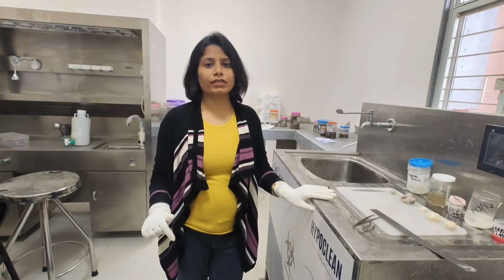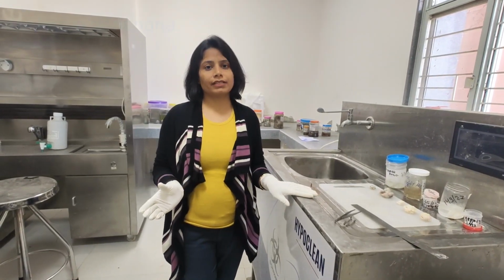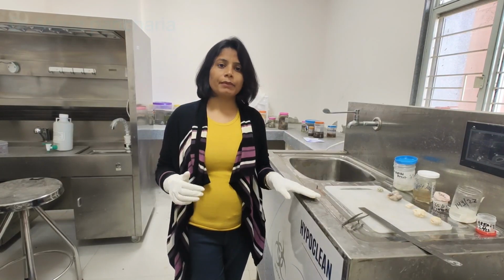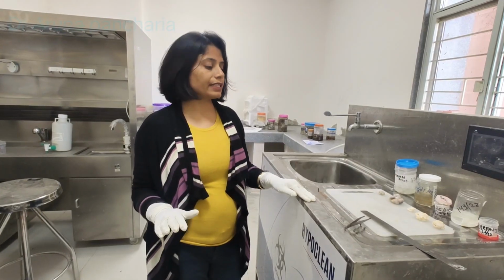Today I am showing you the gross specimen of the fibroadenoma. It is a benign breast tumor and it is generally 2 to 4 centimeters in size. The age group it is seen in is reproductive women, but exceptionally it can be seen in any age group, and the size may vary up to 15 or 20 centimeters.